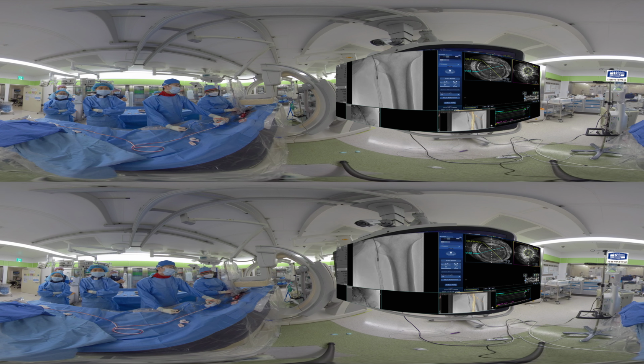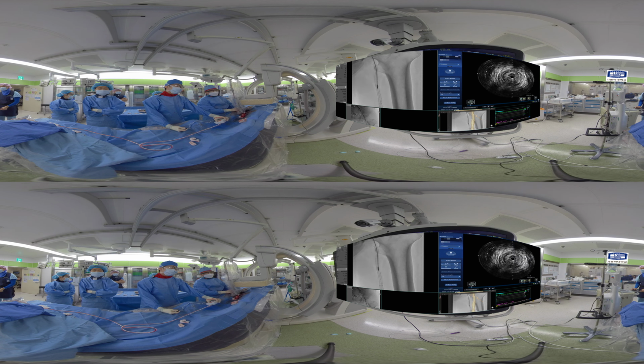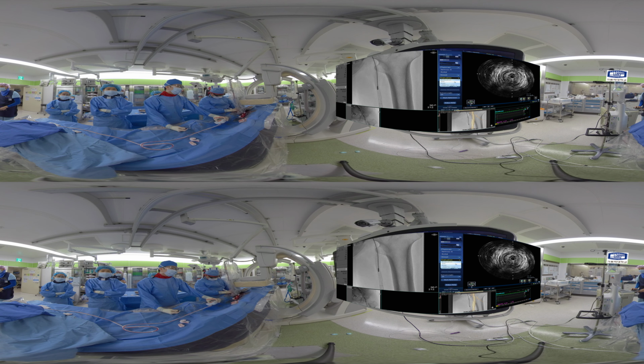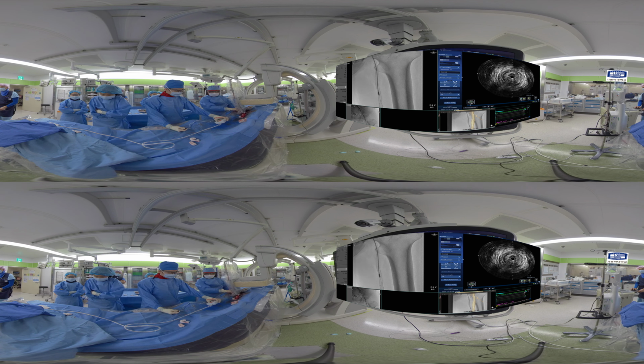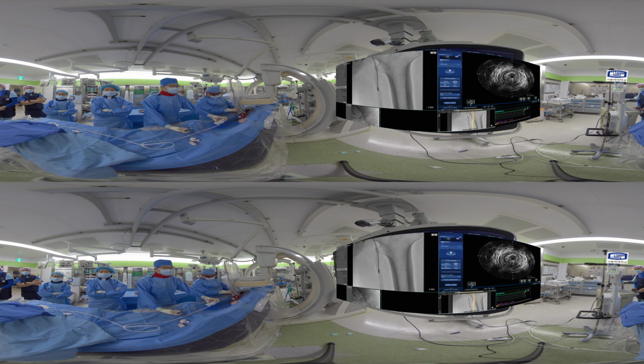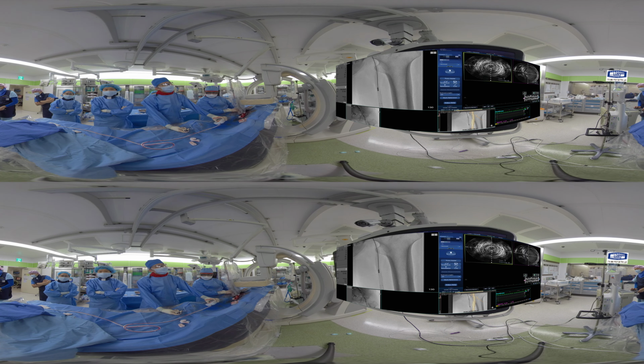The JETstream catheter needs to be advanced slowly, 1 millimeter per second. A distal filter is usually required for calcific lesions and ISR lesions. Stent can be fractured by the atherectomy blade and should be checked with a large view during the atherectomy operation. In this case, a filter was not placed due to long access and long lesions.